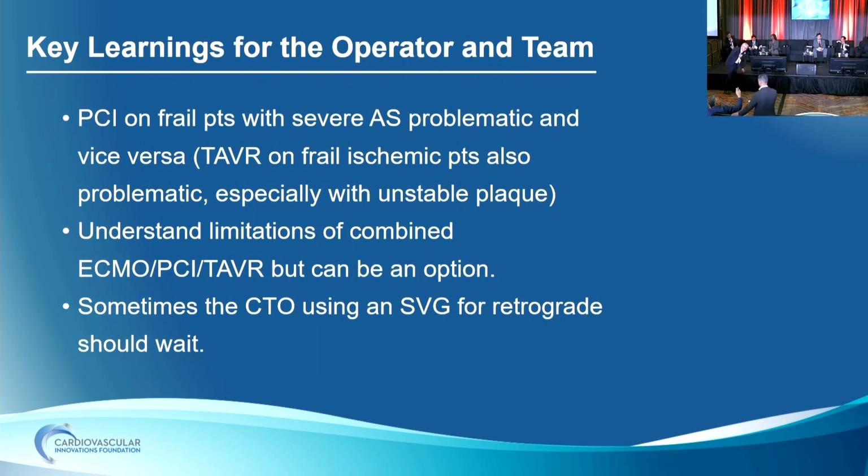Actually, you have the stability, and usually you'd use an Impella, right, for support. But in this case, with the TAVR in place, that will make the most sense.